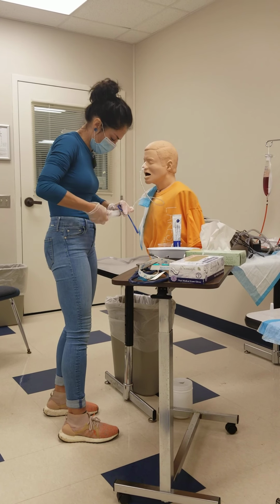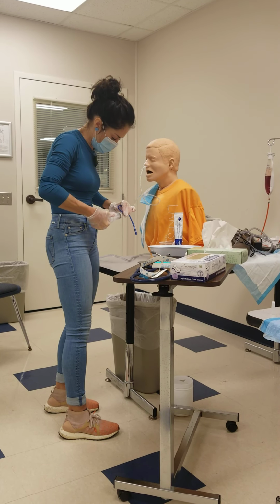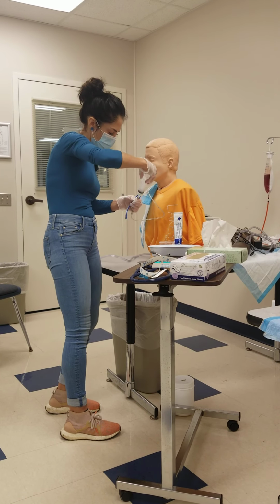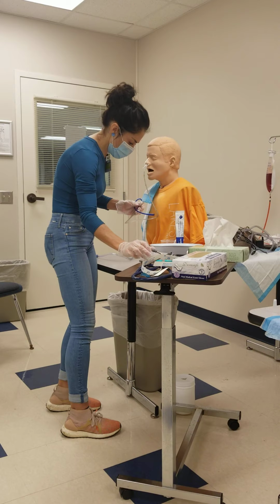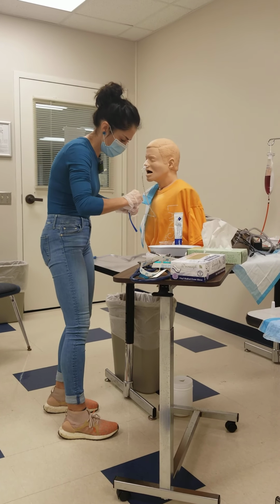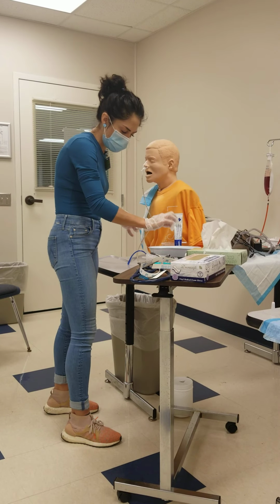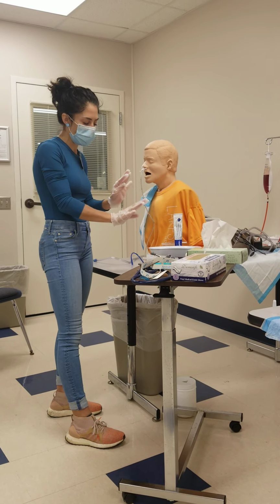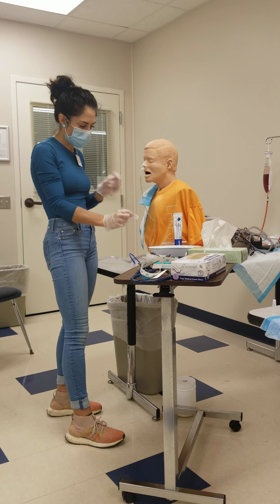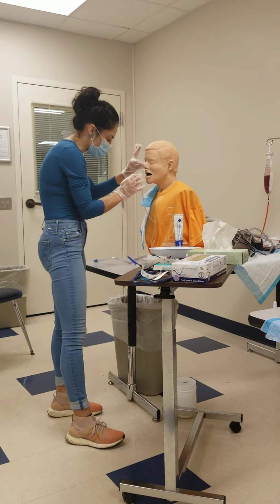Okay, I'm going to aspirate a little bit of the contents. Putting that in there, and then I'm replacing that tube. I'm going to take one of my pH strips. I'm going to test the pH. So the pH of stomach contents should be anywhere from 1.5 to 3.5. All right, let's say it's 2.6. Okay, good. We know we're in the stomach.